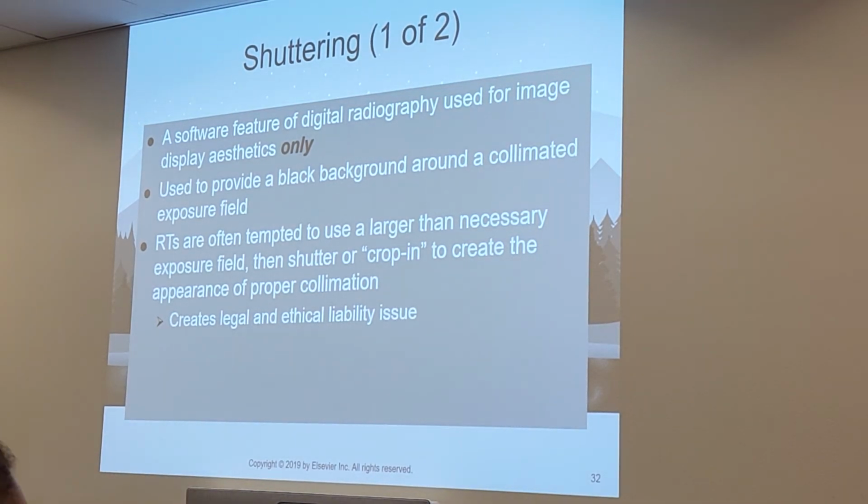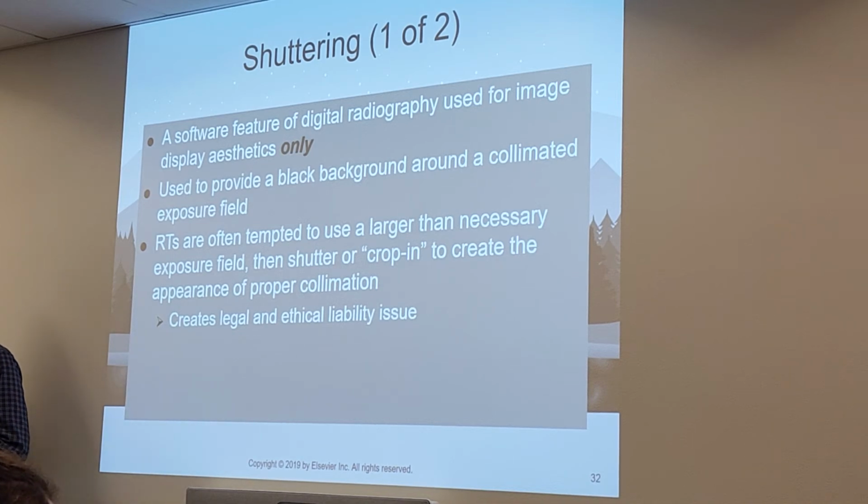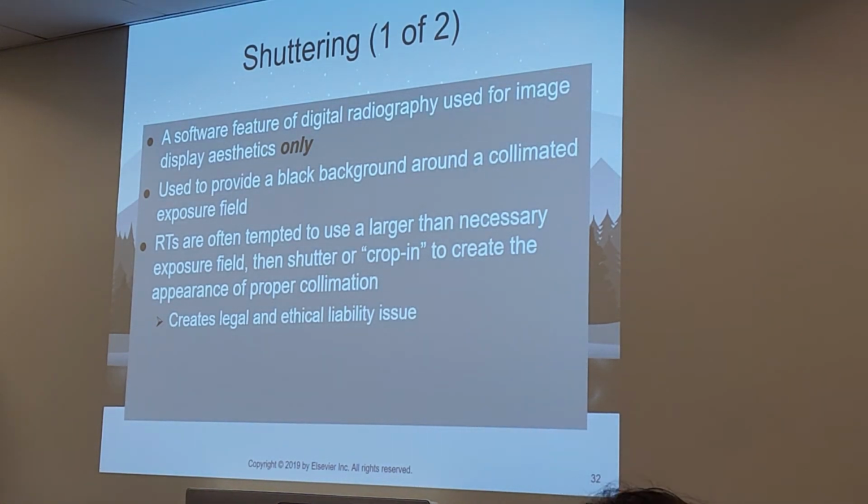Shuttering. Nowadays, we have our images show up on computer monitors. Like most images on a computer, you can edit them. You can Photoshop your images.